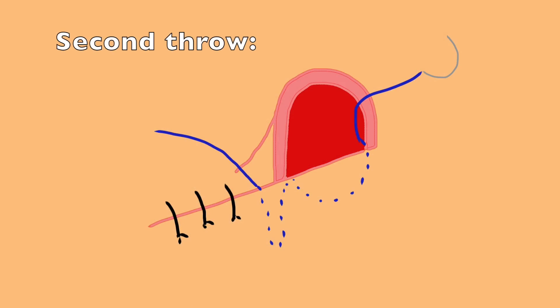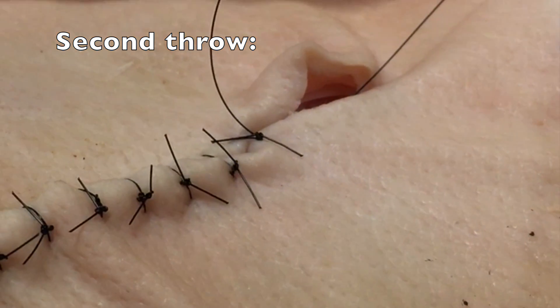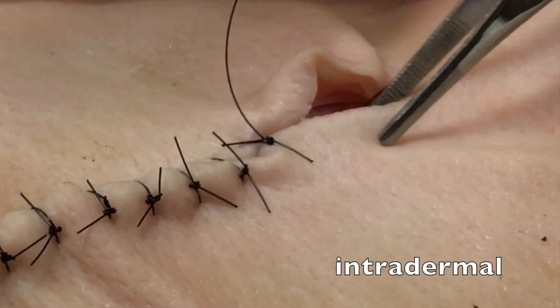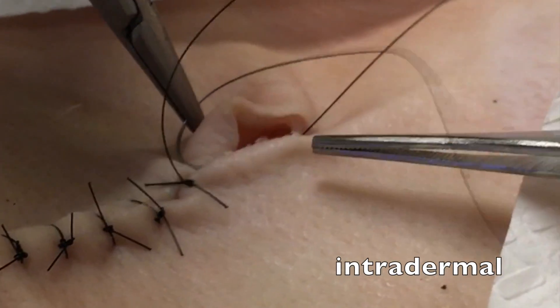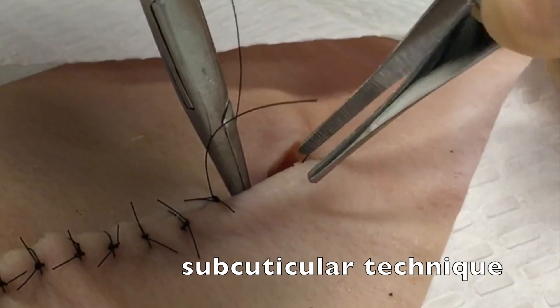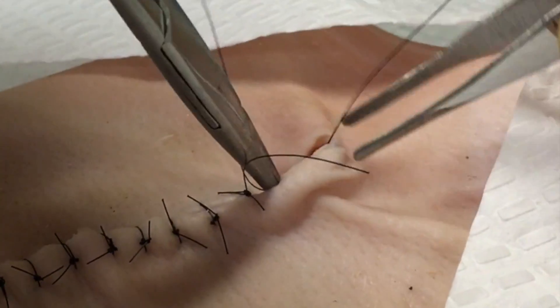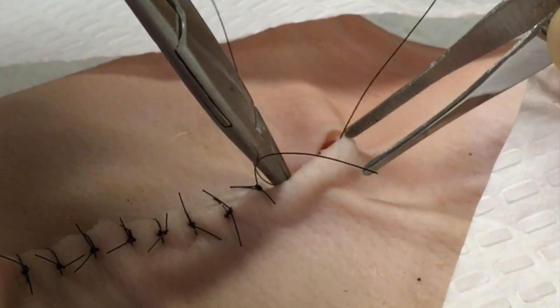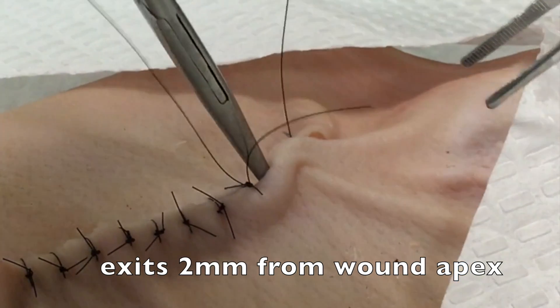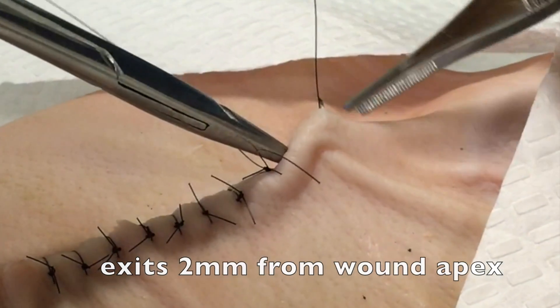Your next throw is going to go in a subcuticular layer along the margin of the wound on the side where the dog ear is not present. That throw goes intradermally. You can use pickups to retract the skin layer to see where you're going. You'll sew with subcuticular technique, almost as if you're doing a running subcuticular suture, and then exit from the wound about 2 millimeters from the apex of the wound.